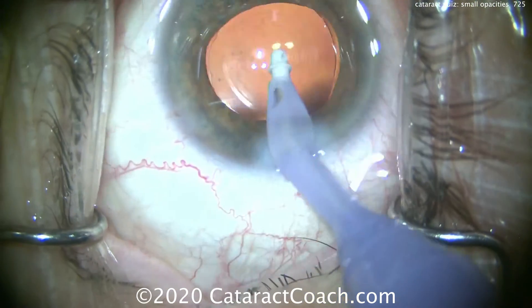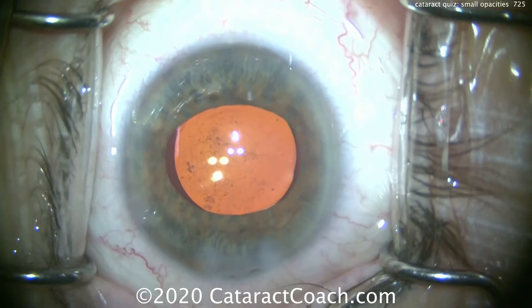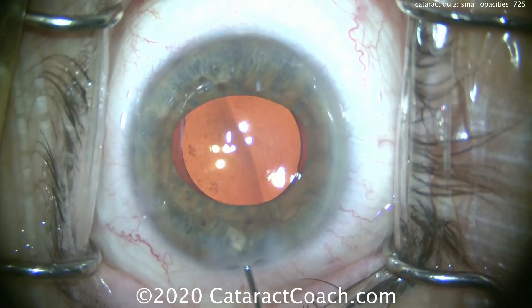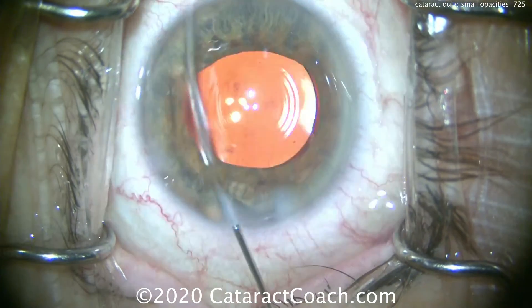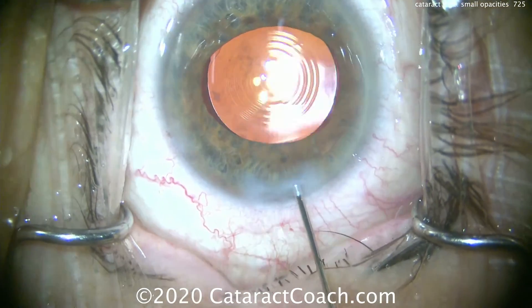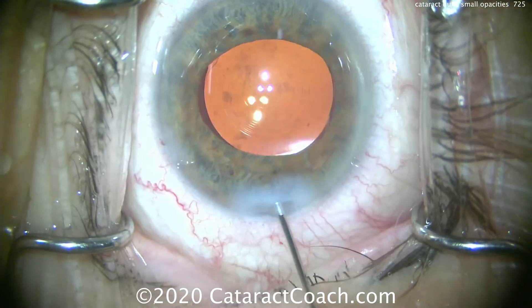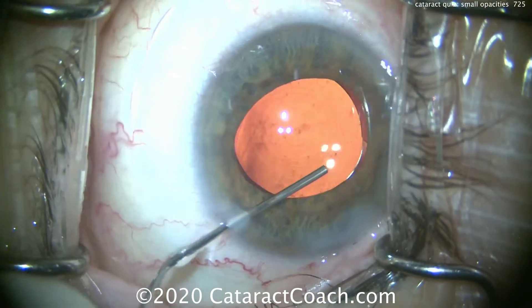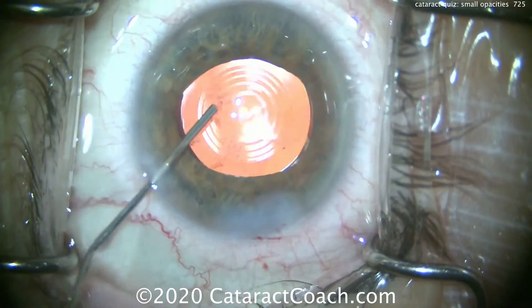You can see the diffractive rings on this trifocal lens and just a few of those particles. Keep in mind, we also increase our red reflex to make these videos — by increasing the sharpness and contrast settings, you see these particles a little bit more prominently on screen.